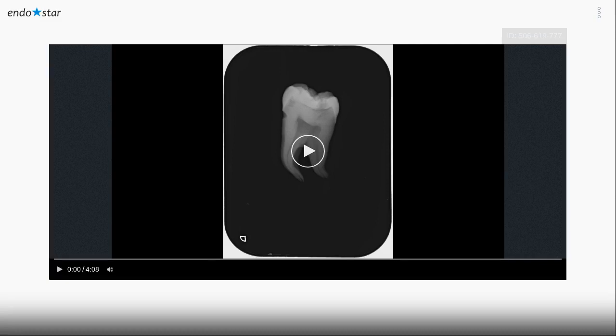In this video, I've gone slightly over the apex for you guys to appreciate how easily the EP file has gone through the curve. You'll be able to see in the x-rays which follow the video, all three canals have used Easy Path EP files.